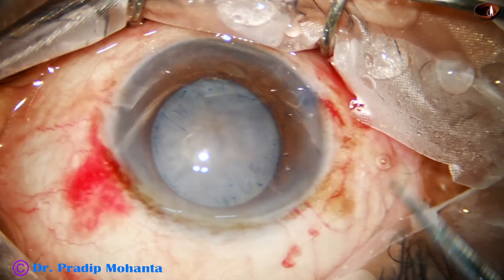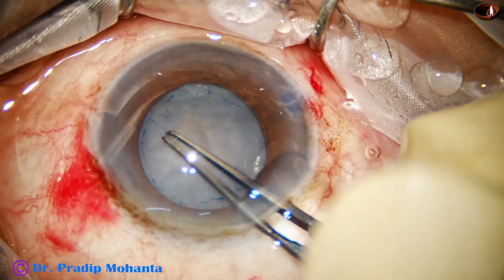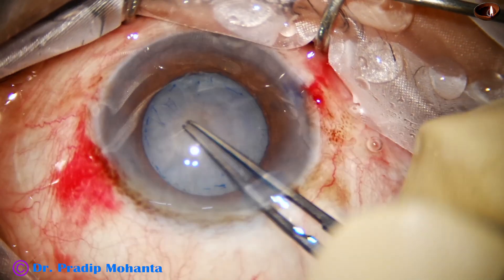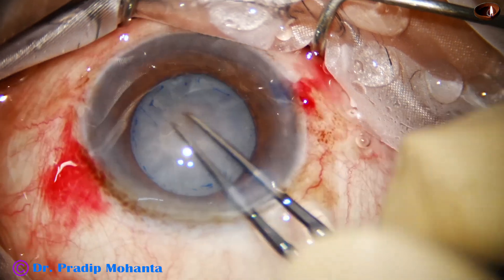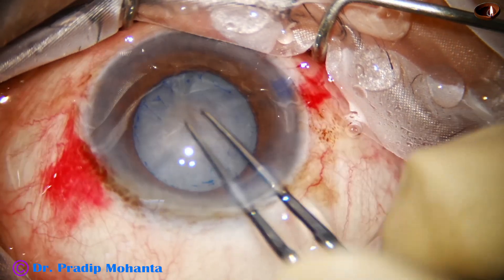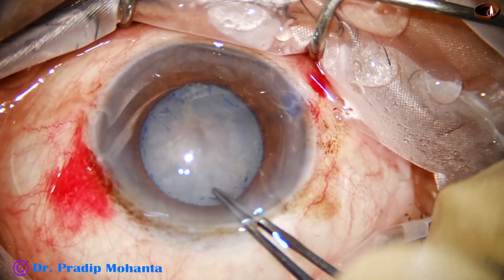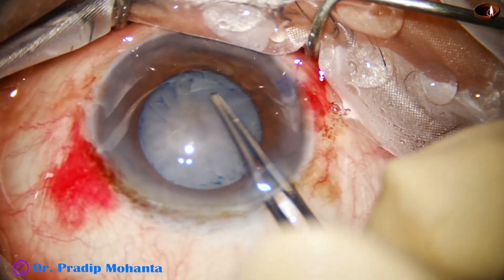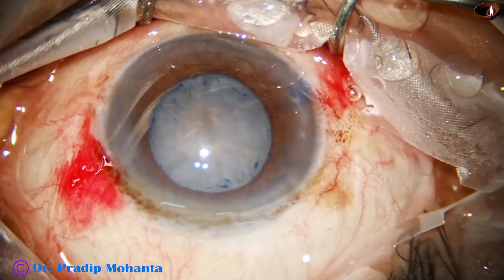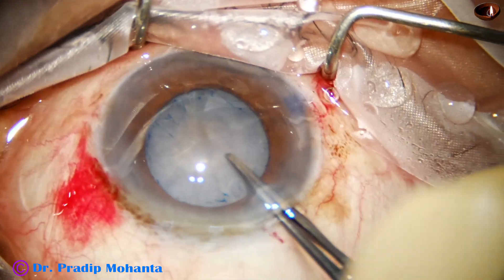Now I have taken the Utrata forceps and this is the anterior insertion — I am detaching its attachment. So there are four places here, and then another place, giving us six places in total where there was anterior insertion of zonule.